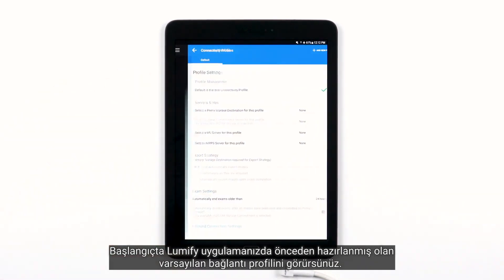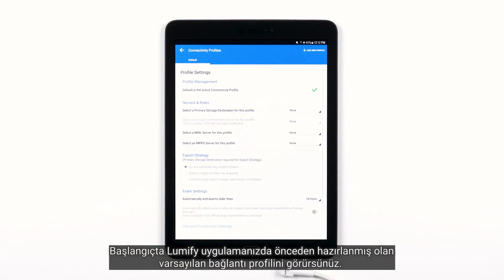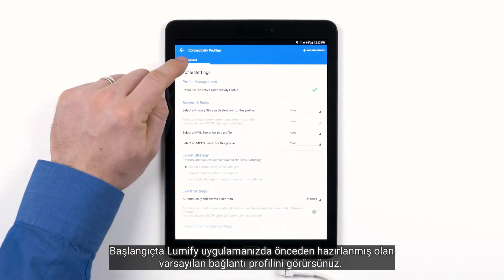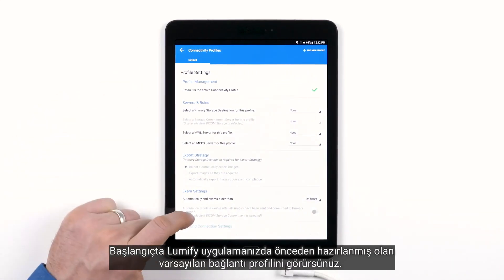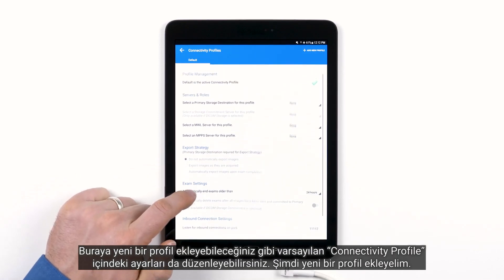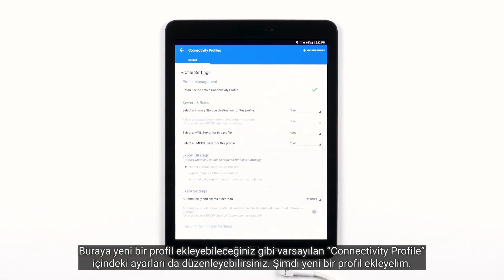Initially, what you'll see is the default connectivity profile that comes pre-populated in your Lumify app. You can add a new profile, or you can adjust the settings within the default connectivity profile.